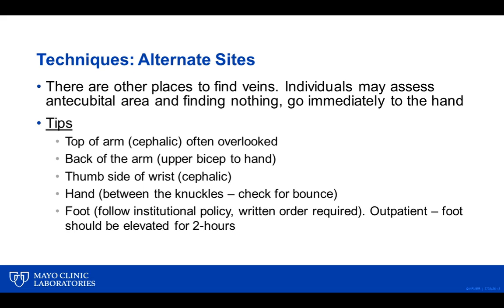Foot stick, you've got it. Like here, we have to get an order for it. It has to be set up by the doctor. If you have to do a foot stick in the outpatient area, they recommend that the patient keeps that foot elevated for 2 hours afterwards. So you'll have to line up a wheelchair for them to sit in so you can elevate that foot for them, and an escort or a family member to take them on from there.